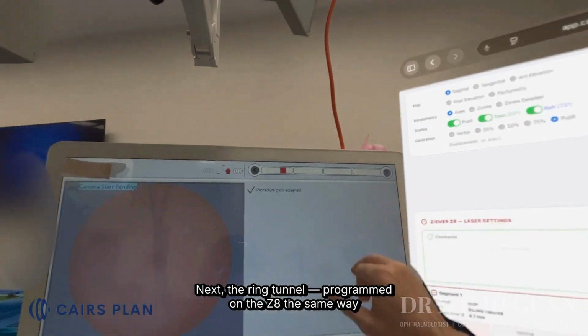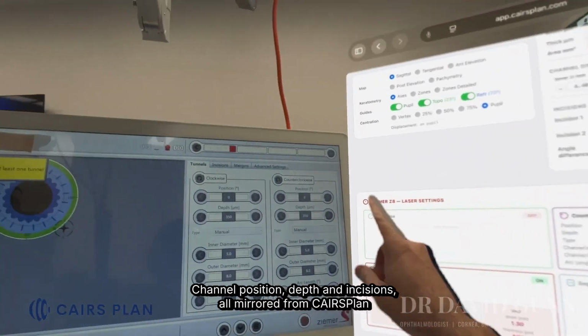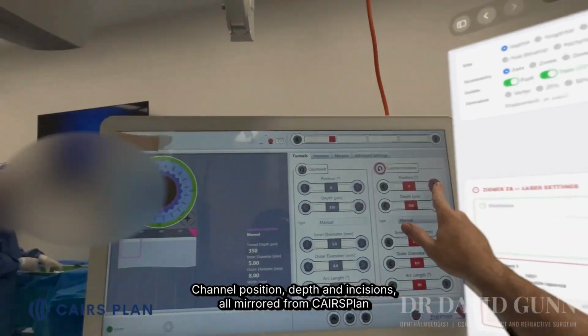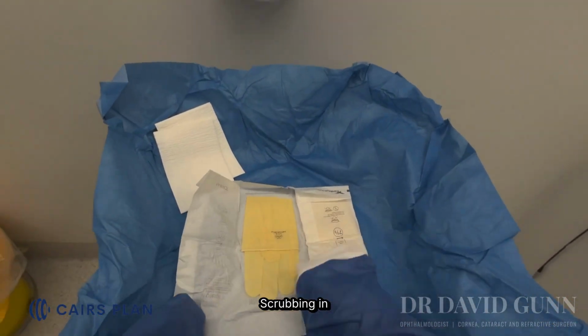Next, the ring tunnel, programmed on the Z8 the same way. Channel position, depth and incisions, all mirrored from CAIRSPlan. Scrubbing in.